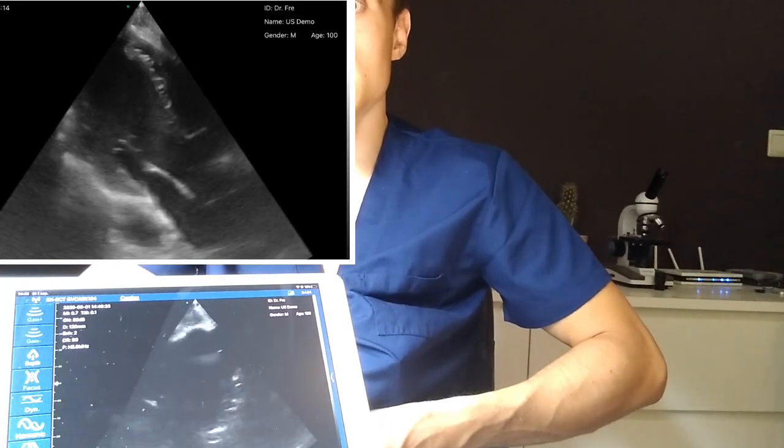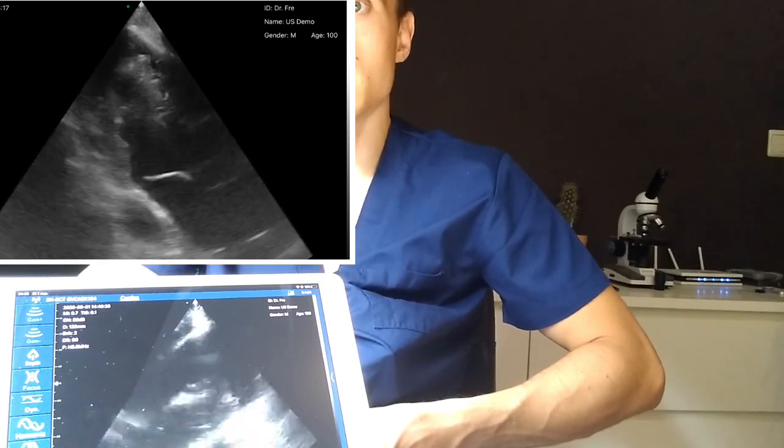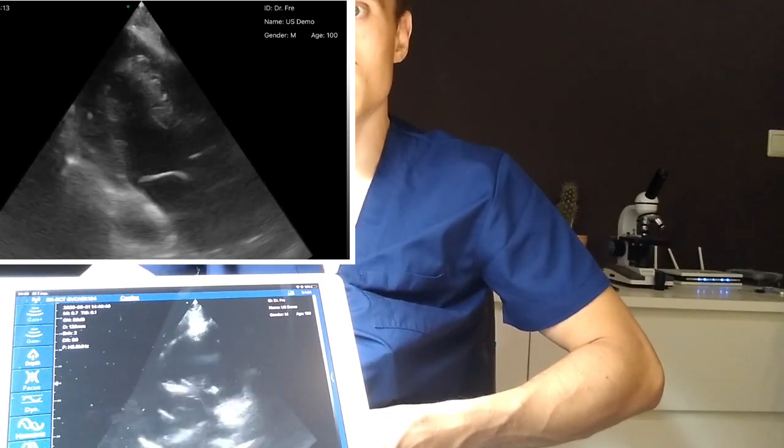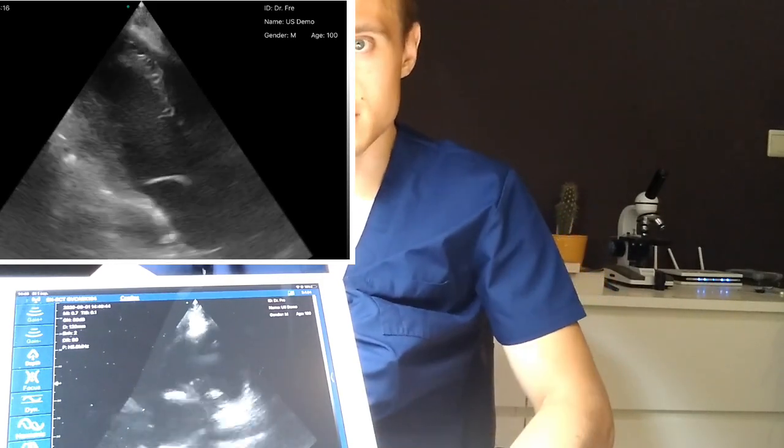Here we have the parasternal long axis view. It gives you a clear view of the mitral valve, the aortic outflow, the left ventricle. You can assess contractility, and so forth.